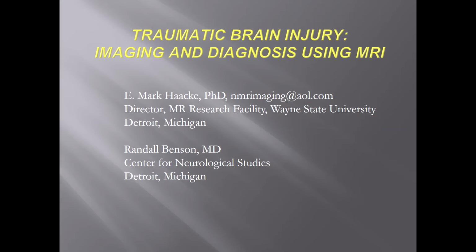This presentation will be a tag team presentation. I'm going to give a brief introduction to some of the imaging technologies used to look at traumatic brain injury, and then Dr. Randall Benson is going to talk about some example case studies in looking at diagnosis and other issues related to patient evaluation.